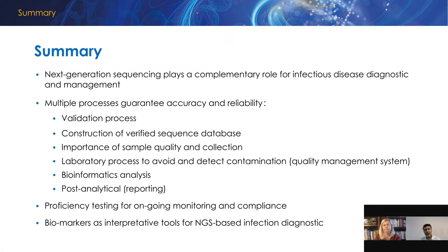Now, when we evaluate the result from the sequencing, we need to make sure that the laboratory is reliable, especially that the process is reliable. We are not introducing any contamination during the process, and the laboratory should be able to provide that. A result should not be released if there is any concern about contamination. And the other point is the sample itself. If the provider reviewing the result was the same provider who collected the sample, it's up to the provider to consider whether the sample collected was significant, or whether there is some concern about possible contamination during the collection. So all those variables need to be taken into consideration.